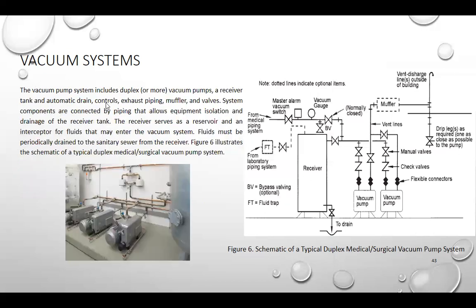So the vacuum pump system includes duplex or more vacuum pumps, a receiver tank, and automatic drain.